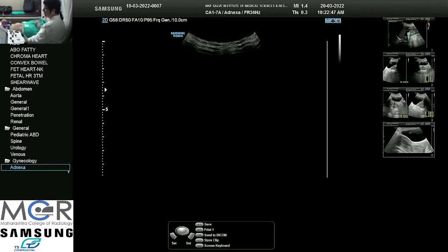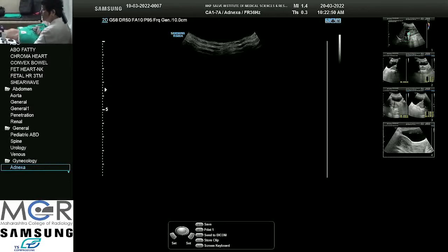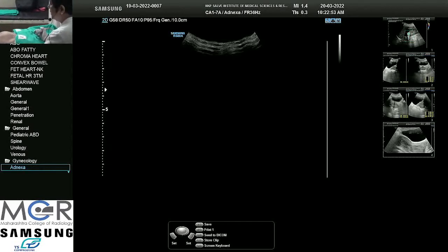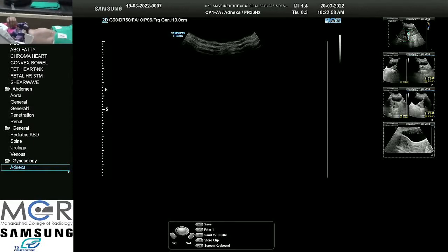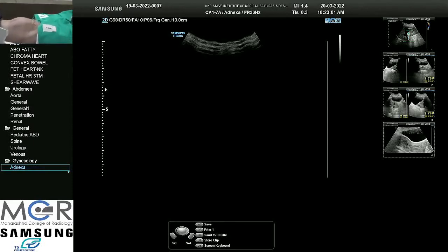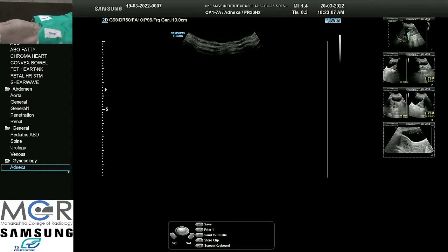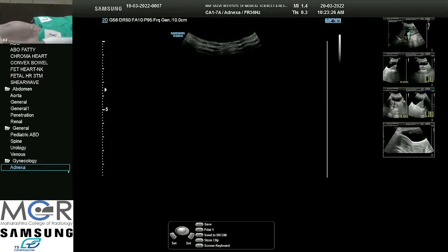We have a 38-year-old lady who has not had her period since last one year. She is worried and her urine pregnancy test is also negative. Initially she had regular periods and she has two children. We have made her comfortable and covered her properly. You can see that I have put markings R and L — R represents the right side of the patient and L represents the left side of the patient.